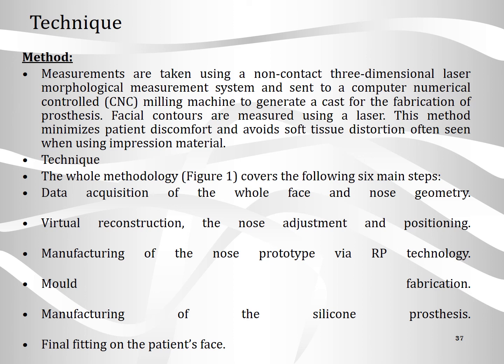So coming to the technique, measurements are taken using the non-contact 3D laser morphological measurement system and sent to the computer numerical control, that is the CNC milling machine, to generate a cast for the fabrication of prosthesis.